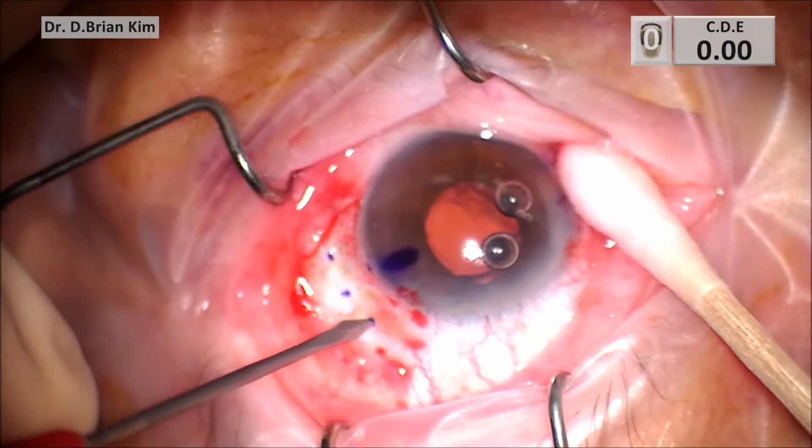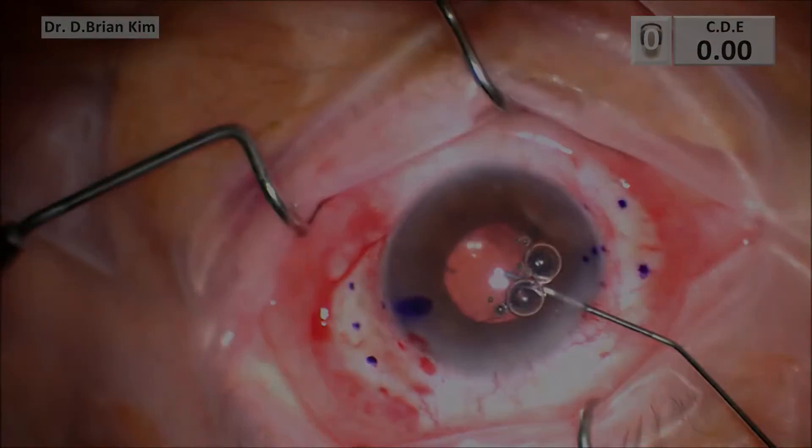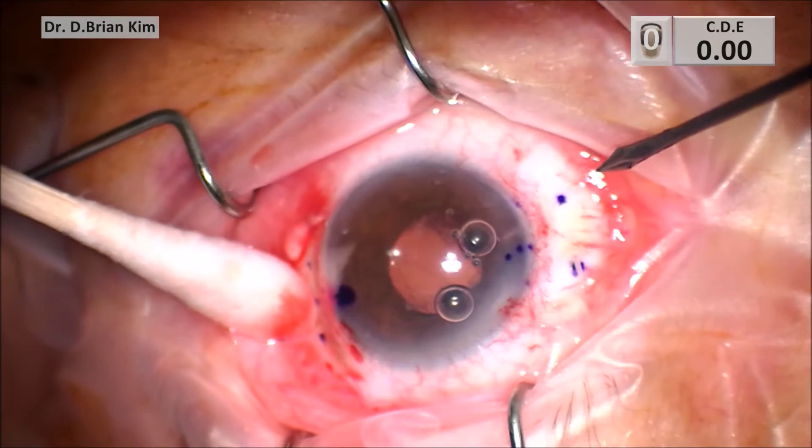I'm using an MVR blade to make my sclerotomies. I inject viscoat into the anterior chamber to stabilize it. And I perform my other sclerotomies on the other side.